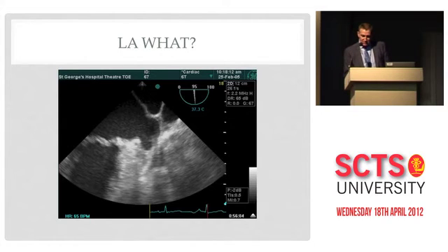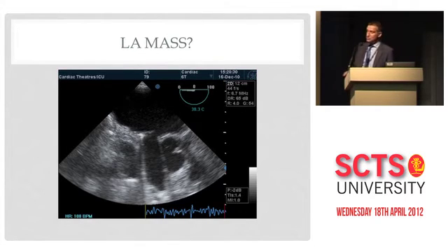Anyone want to tell me what this is? Spot diagnosis, really. That's our left atrial appendage, but there's a little bit of weirdness going on just above it. For anyone who does congenital work, this is a partial cor triatriatum. So you can see there's a membrane arising from just above the left atrial appendage around the pulmonary veins. That was an incidental finding in theatre. Those patients either usually die or require surgery very early, or survive completely unbothered by it.